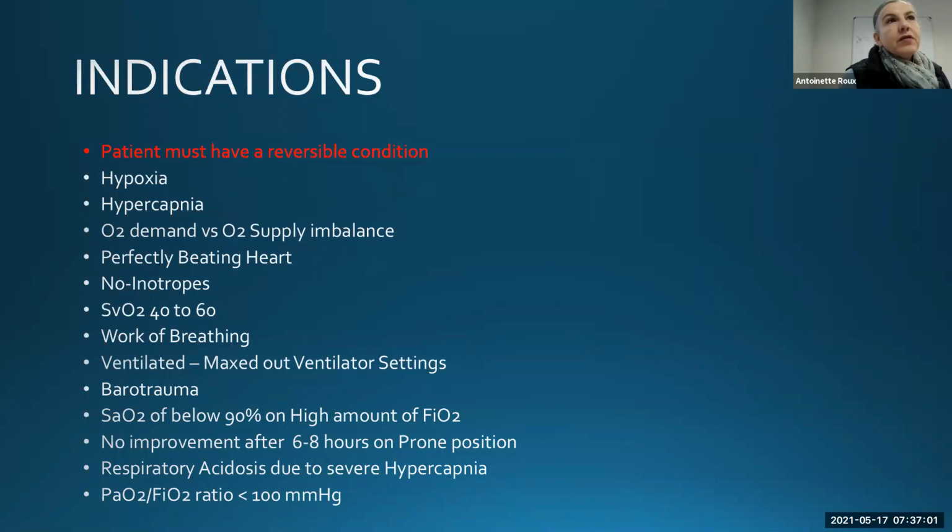So now you start fiddling with your ventilator. You'll up your oxygen levels, or your fraction of oxygen, to 100%, but your PO2s will still be 50. And your CO2, you'll try to manipulate with your tidal volumes and your pressures and so on. So now you're on a rate of about 20 and your CO2 is still not getting where it's supposed to be.